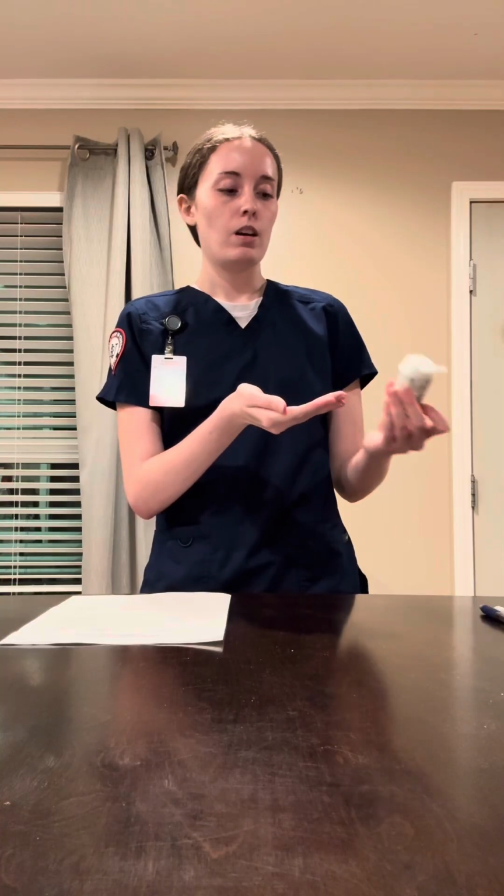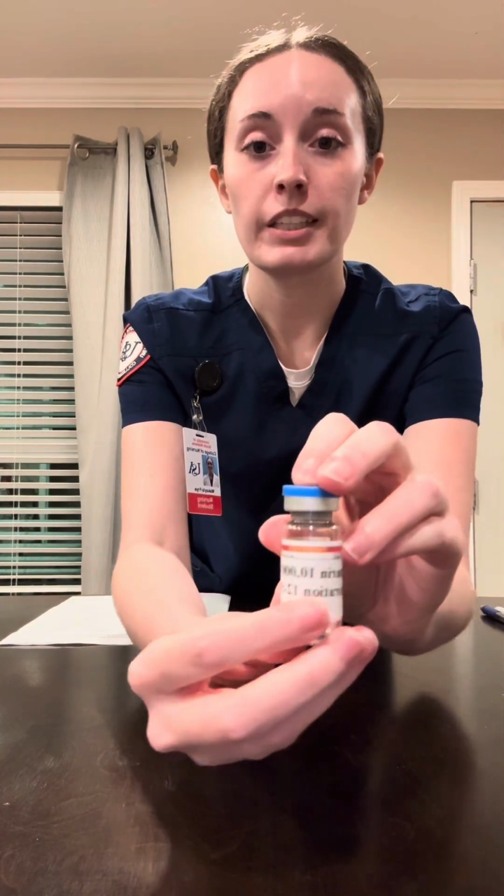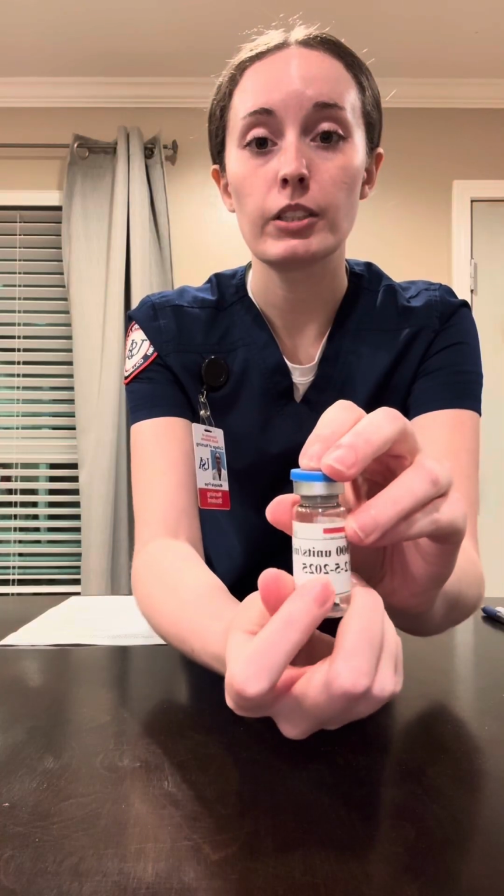Okay. So the next thing that I'm going to do is just apply some hand sanitizer. Okay, so now I'm just going to show you my medication. So this is heparin, 10,000 units per milliliter. Expiration is 12/5/2025. Okay, so this is where I begin my first check of the 7 rights of medication administration.